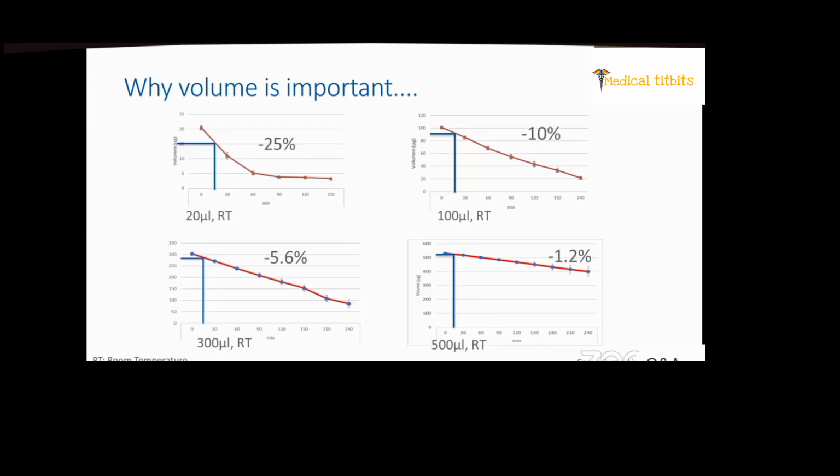Ideally, each cryopreservation case should be treated the same way in terms of time, volume, temperature, media, and quality, etc. This way, variation between cases and operators can be minimized and consistency in outcomes increased. Clearly, use of larger volumes will make it less likely for environmental changes to affect outcomes.